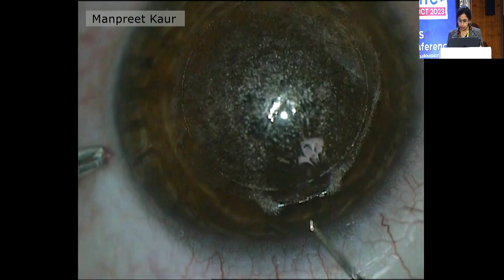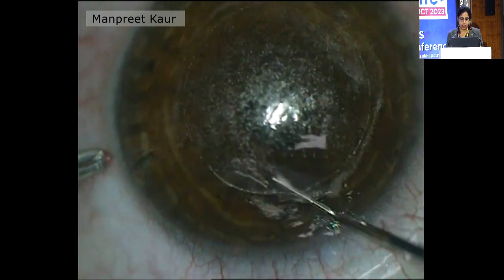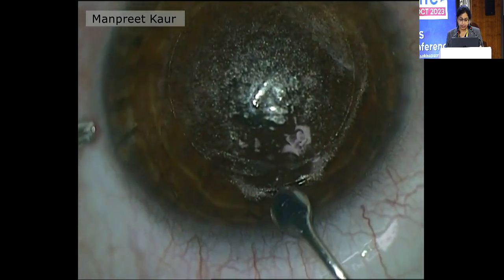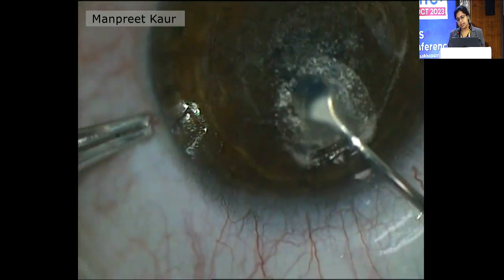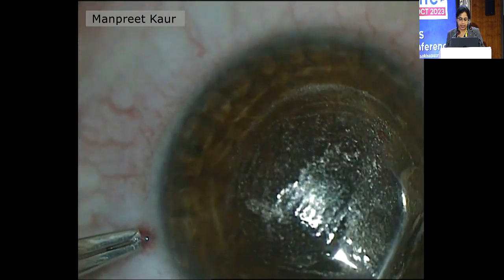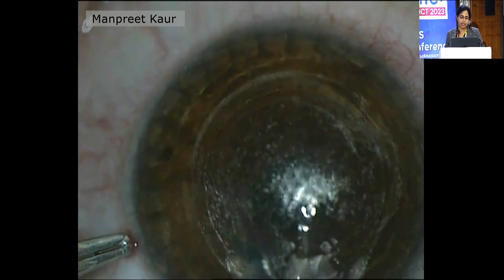So this is a case with confirmed cap lenticular adhesion. I know I've gone wrong and dissected the posterior plane first, so I just go in with the sharp end, nudge the lenticule off from the overlying cap, delineate a small channel so I can make my dissector enter anteriorly, now between the cap and the lenticule. Follow the same principles as I would have had I done the anterior dissection first and then posterior: go opposite and dissect, leave small areas of peripheral adhesions, and then keep on dissecting as you would if you were going posterior later, and then just take it out.